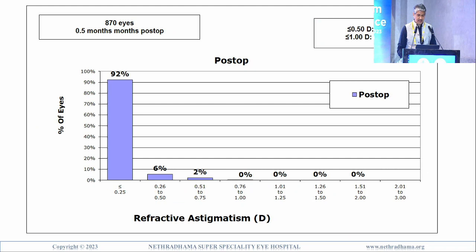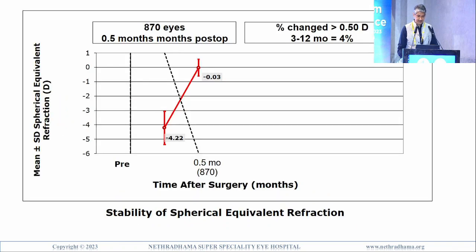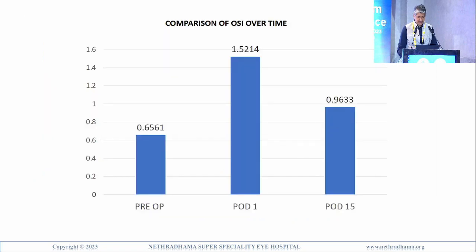And this is the refractive astigmatism. Again, correction is better because of the cyclotorsion compensation and the nomograms used. 98% less than 0.5 diopters and 100% within 1 diopter of cylinder. You can see that 92% within a quarter of diopter of cylinder. And this is the stability over time, but this is only 15 days, so it's not very significant.